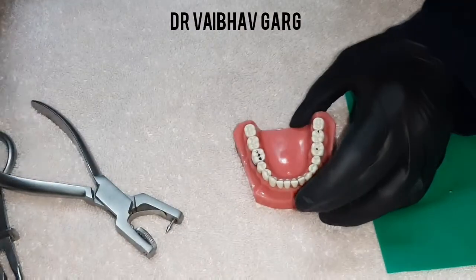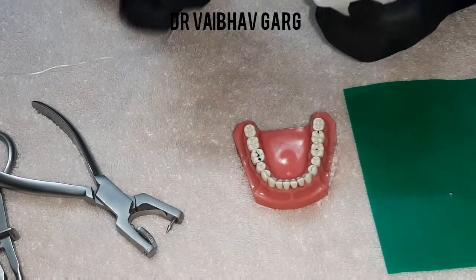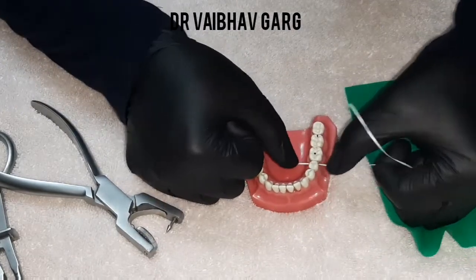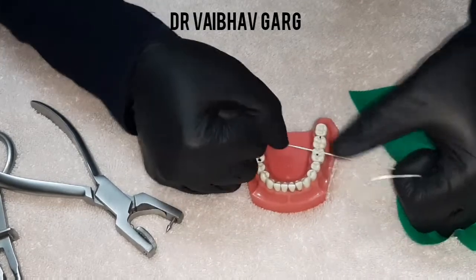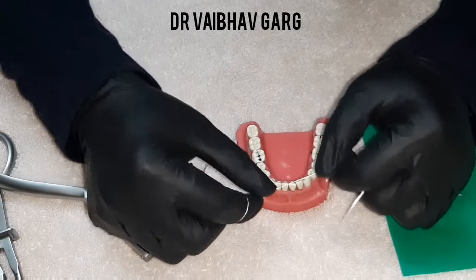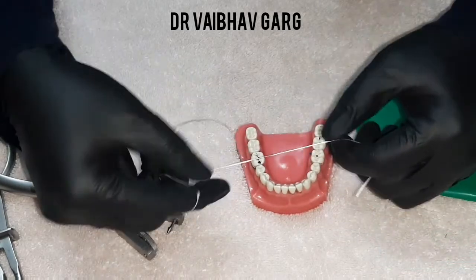Before starting, check that there is interdental space and proper room to move the rubber dam sheet. If you miss this step, the rubber dam might tear or may not reach between the teeth, so make sure there are no flaws.